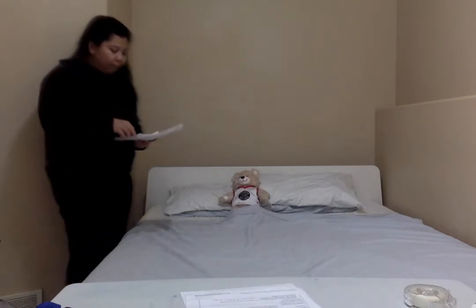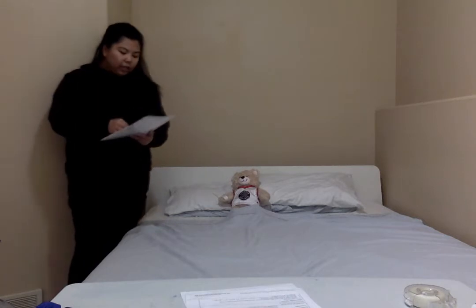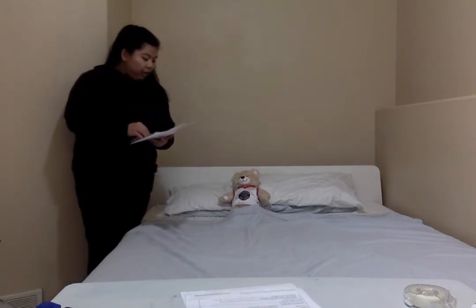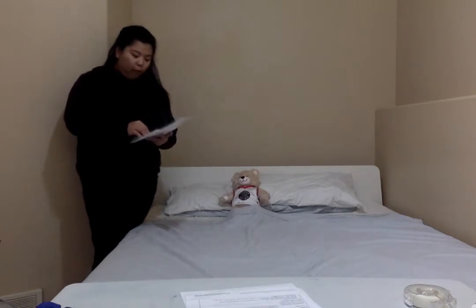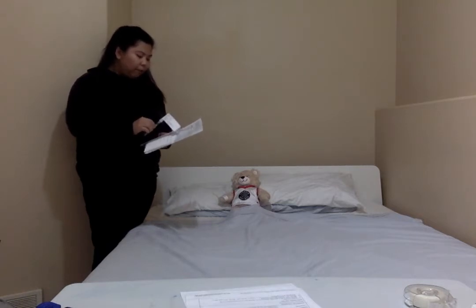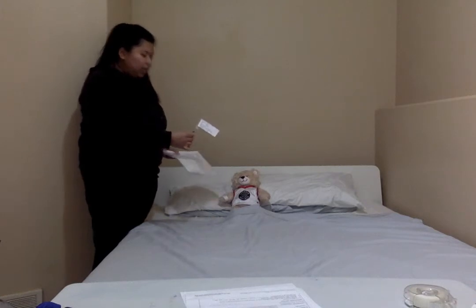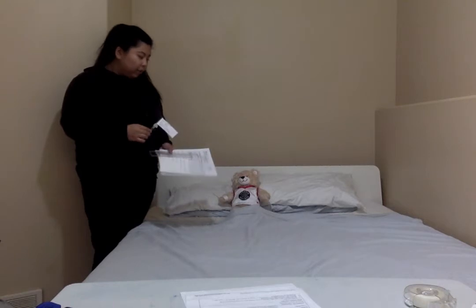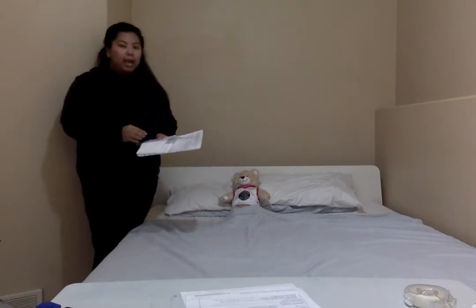All right, perfect. So Jake, this medication that I have here for you, it's called heparin. This is a blood thinner. It was prescribed by your doctor for you because you are not able to move around as much. So this is going to prevent the clot from happening. And this medication is an injection, and it is recommended that it goes into your abdomen. Is that okay? Okay, Jake says yes, that's fine.